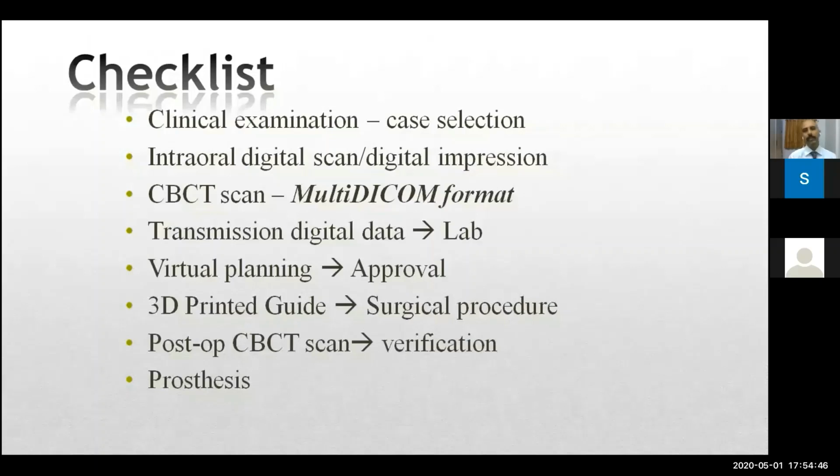And then for the purposes of verification, you may also obtain a post-operative CBCT scan. Once you see that the implant is in the perfect position that was desired, as was planned, if that is suitable, then either an immediate loading of the prosthesis can be done or a delayed loading can be done as per your clinical judgment and decision.